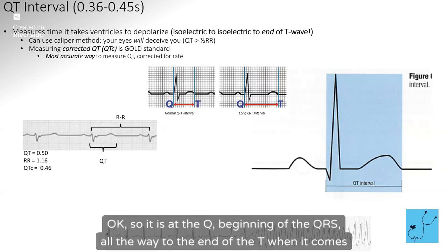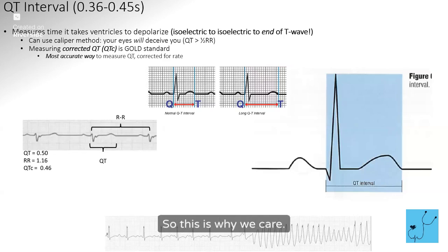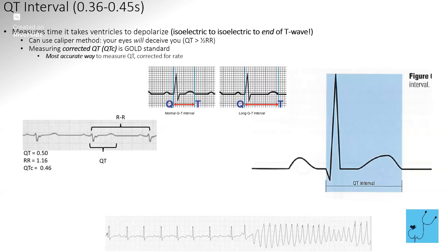Okay, so it is at the beginning of the QRS, all the way to the end of the T when it comes back to the isoelectric line, is where we're measuring that. So this is why we care, because here we are, marching along, and then all of a sudden we're in a torsades. Okay.